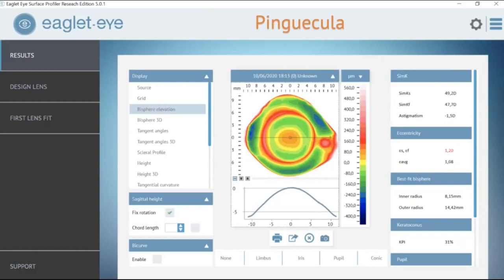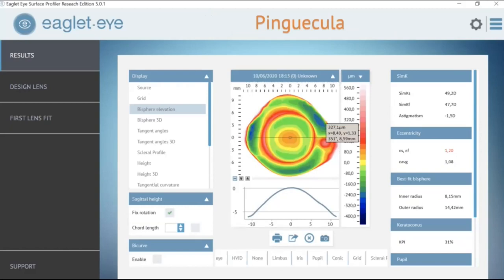We all encounter pingueculas — here in Texas we see a lot of large ones, and they're always a challenge in fitting lenses. With the ESP and its mapping software, we get the height, width, and exact location of scleral abnormalities such as a pinguecula. This is very important to communicate to the lab, whether you're designing a microvault, a notch, a CPR, or another solution, so we can have precise measurements to improve the lens fit.